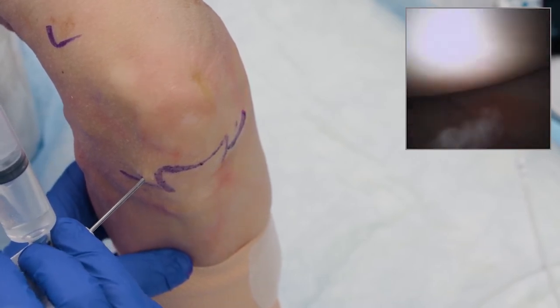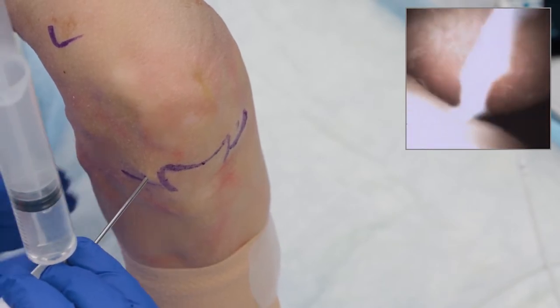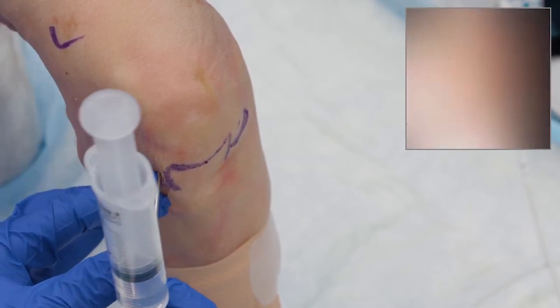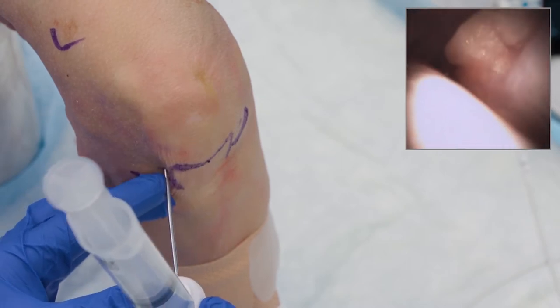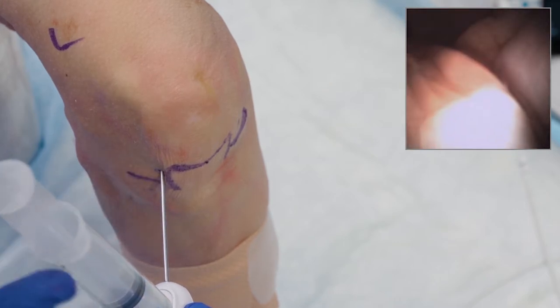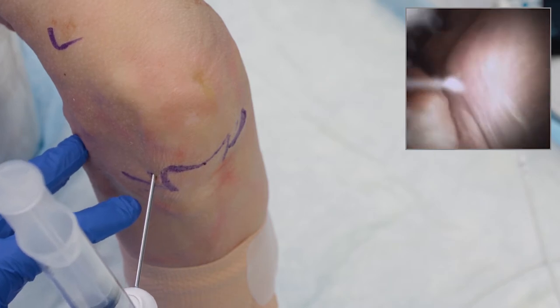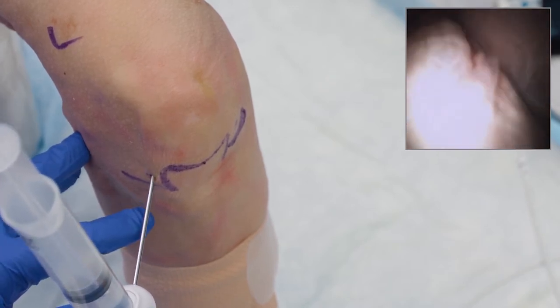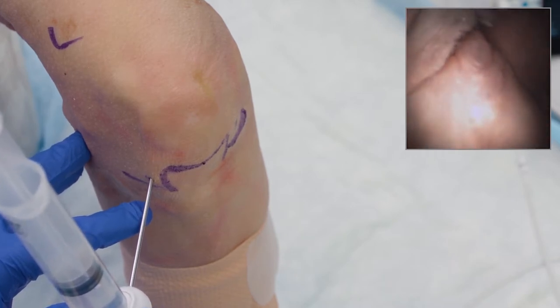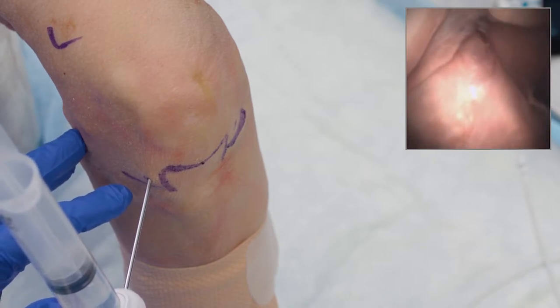From here I'll swing back a bit, let the leg go back to neutral or 90 degrees of flexion, look at my cartilage one more time, then adjust my hand to swing up towards the ACL. The fat pad lies right there so you want to be careful. Without using much fluid, I'm able to see my ACL fibers really well. I can give a little flush to make them flutter, and I'm also looking at my PCL fibers coming down as well as the ACL. If you want a different perspective — since it's a zero-degree scope — you can switch to the medial side and watch the fibers run up and attach onto the femoral condyle.